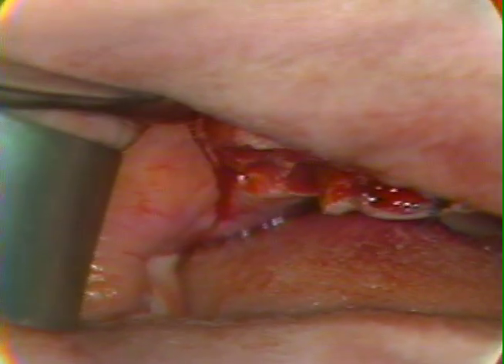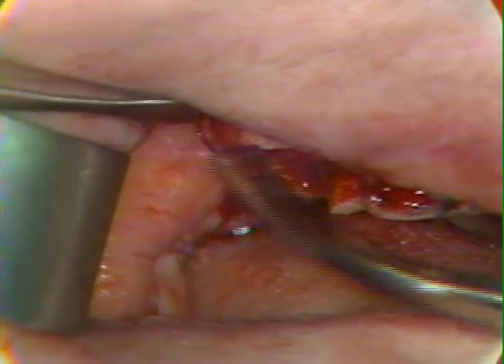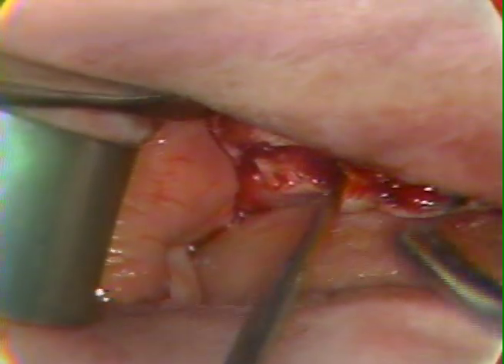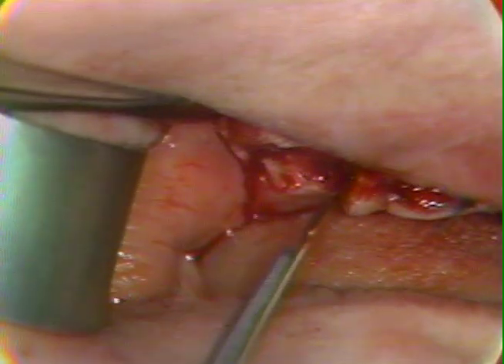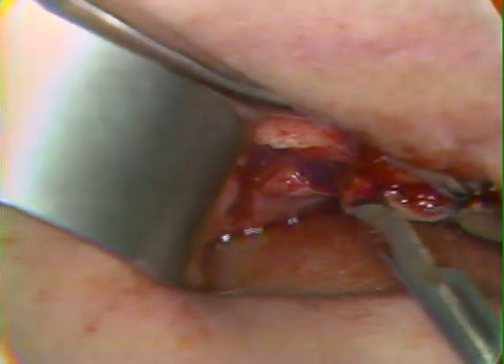Use most anything to do that, but that's one way to get it out of the field, and doesn't damage the instrument. The rongeurs can be used to manage soft tissue, but should not be used as a forceps on enamel or crown surfaces. So that flap then should return to place, and we'll show the final suturing here in just a moment.